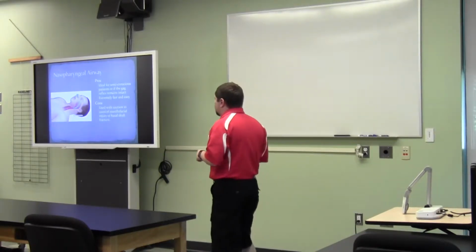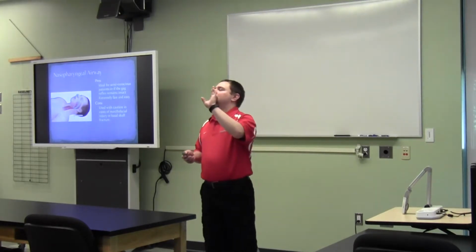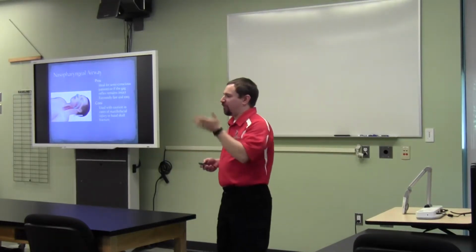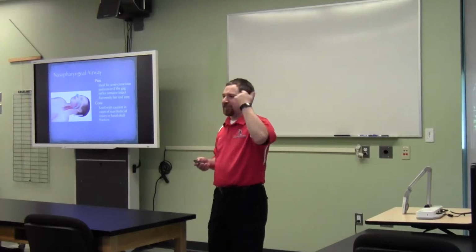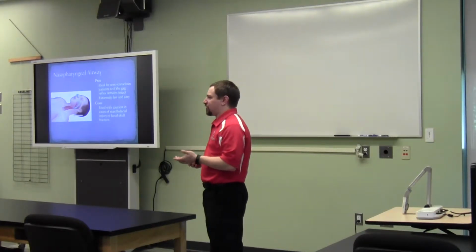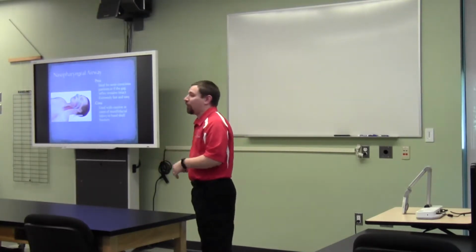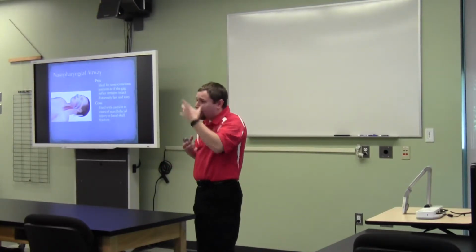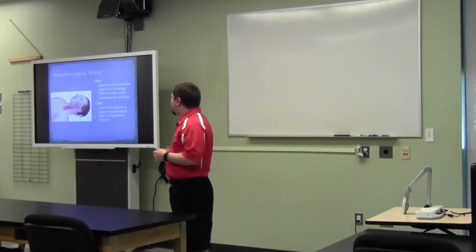Cons, all right? Now the answer is you should just be careful if you have facial injuries with these, because once again, you don't want to snake this thing up into a sinus. You don't want to stick this thing into their brain if they actually had something serious. But that's where we're still evaluating those patients. Is there cerebral spinal fluid coming out? You know, are they getting facial elongation? Any of those things really? No, that doesn't look right.